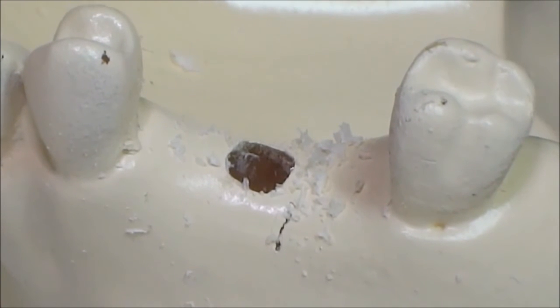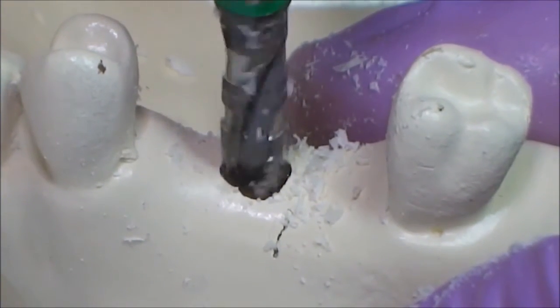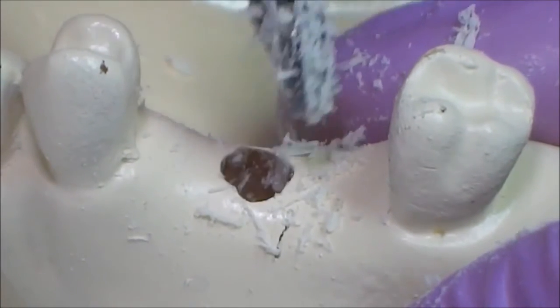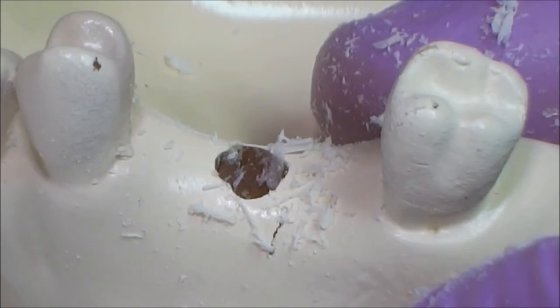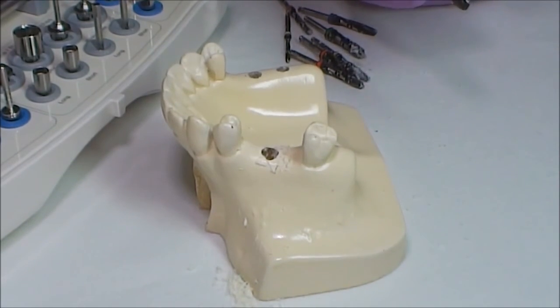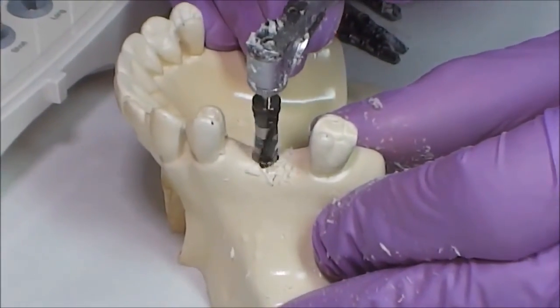The next drill is 4.7 millimeters in diameter, which prepares the site for a 5.0 millimeter diameter implant. Note that when drilling at low rotations, you obtain bone remnants which can be used for further accompanying bone grafting. The next drill is 5.2 millimeters in diameter; this drill prepares the site for the 5.5 millimeter diameter implant. We decrease the number of rotations accordingly.